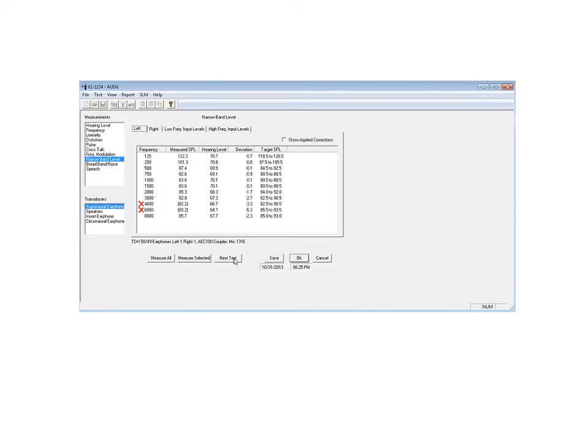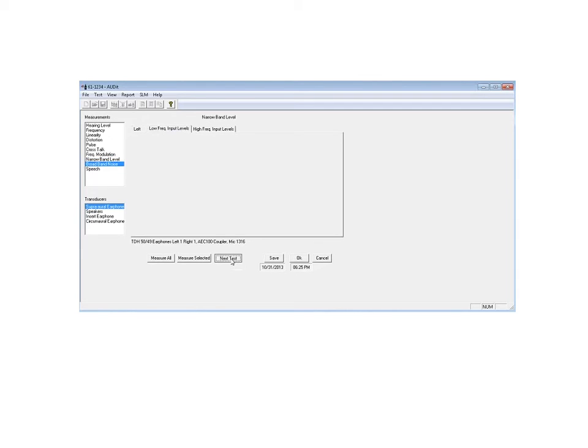As we go to the next test, there's again the broadband noise. That's the white noise. This is commonly referred to. And then the last test would be speech.